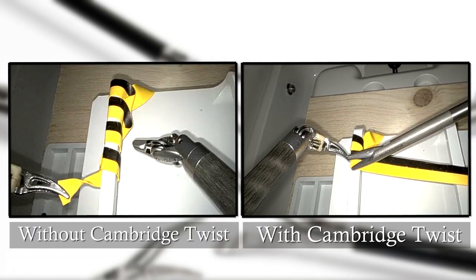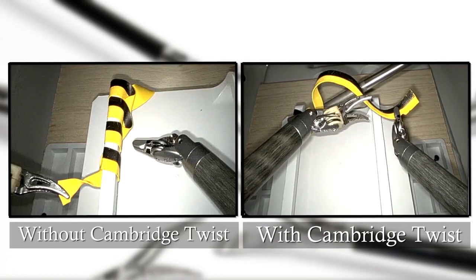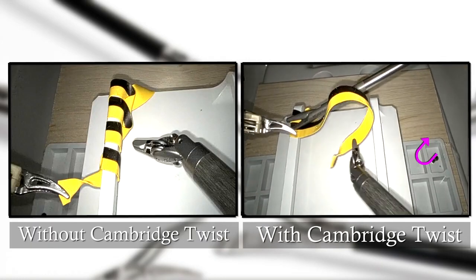On the right side, the needle holder is turned, providing a smooth laying down of the ribbon and a harmonious suture.